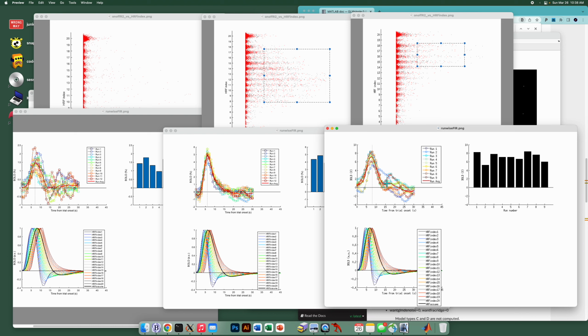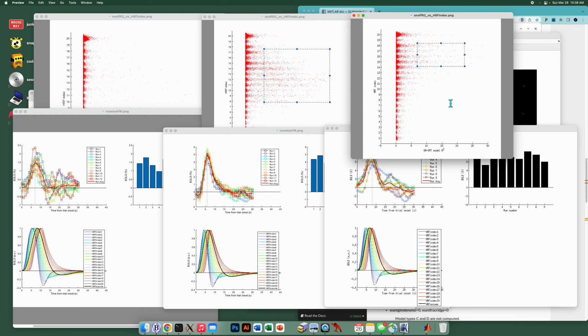Now, looking at the time courses again, we can confirm that these time courses that are derived from the data itself are fairly late compared to the library, and that should correspond to indices roughly from 14 to 18, which would be more of an orange to dark red color. And again, if you zoom in carefully with your eyes, you can kind of confirm that this does seem sensible. Bear in mind that, again, this look at the data is critically dependent on the top 1% of the voxels, so it may or may not be completely accurately matched to what you see up here.